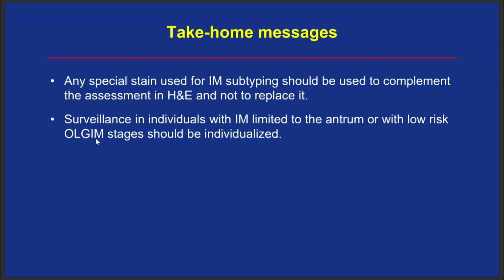And finally, the surveillance in individuals with intestinal metaplasia limited to the antrum or with low-risk OLGIM stages should be individualized. And these are my acknowledgements, and thank you for your attention.